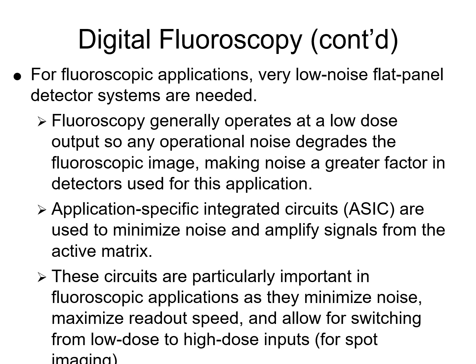So low noise. Noise is trouble in digital imaging. And you're not thinking scatter radiation, because you were taught well by Mr. Shepard. Yes, Compton creates noise in the remnant beam, but we're talking about electronic noise. When you operate an electronic device, it generates its own internal noise. What is that? Well, it's like phantom resistances that you weren't expecting.